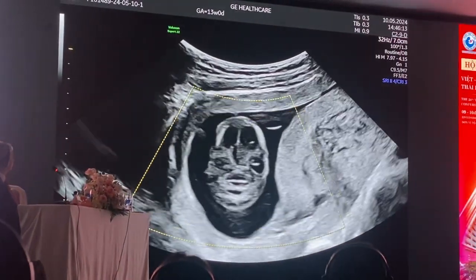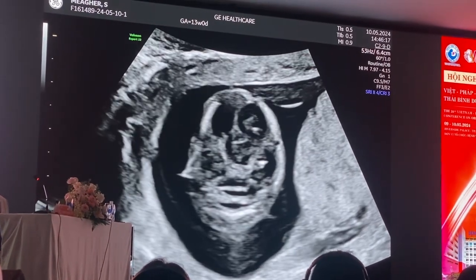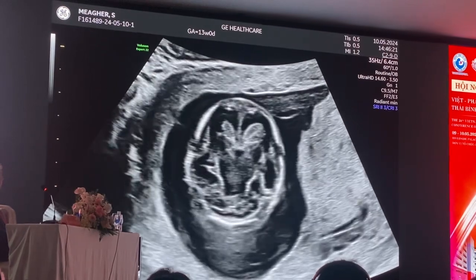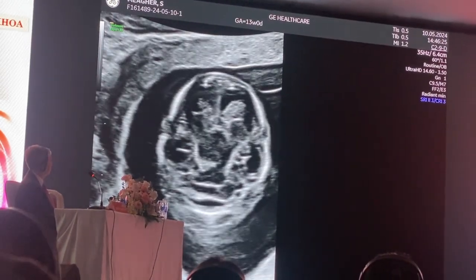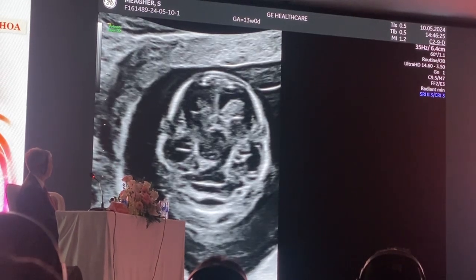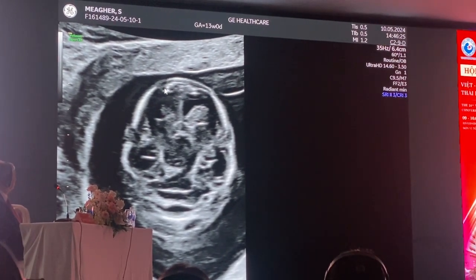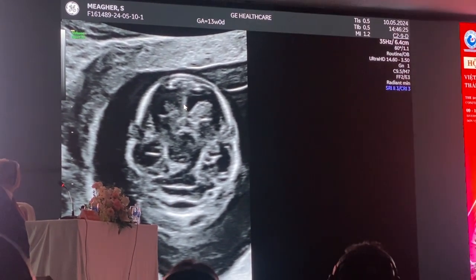When you come along to this image here, I'm going to just zoom this image, I'll just save a cine and come back to it, but yeah, thanks very much. So in this image, I'm going to split the image in two, and I'm going to show you that this is a very important landmark here. This here is the anterior horn of the lateral ventricle on both sides, and I'll tell you why that's important in a second, but I'm just going to do something different.